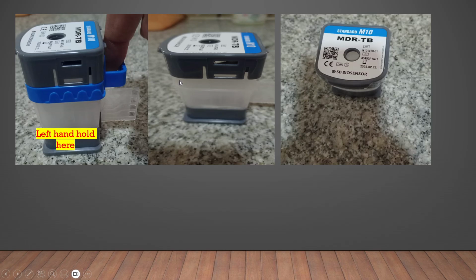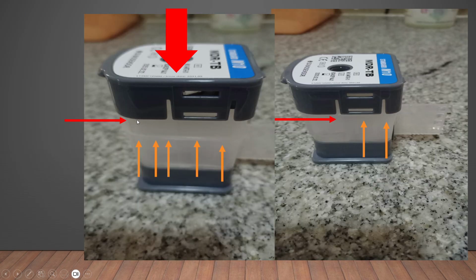Now once you pull it out, see, this comes out very easily. So this is the space that is present, and this is how it looks, and then you need to press it hard. As you can see, there is a line here, and this is the gap on which that plastic was sitting. Now you compress it fully, in one single go. You need a little bit of effort to actually compress it down. Compress it in one single go.